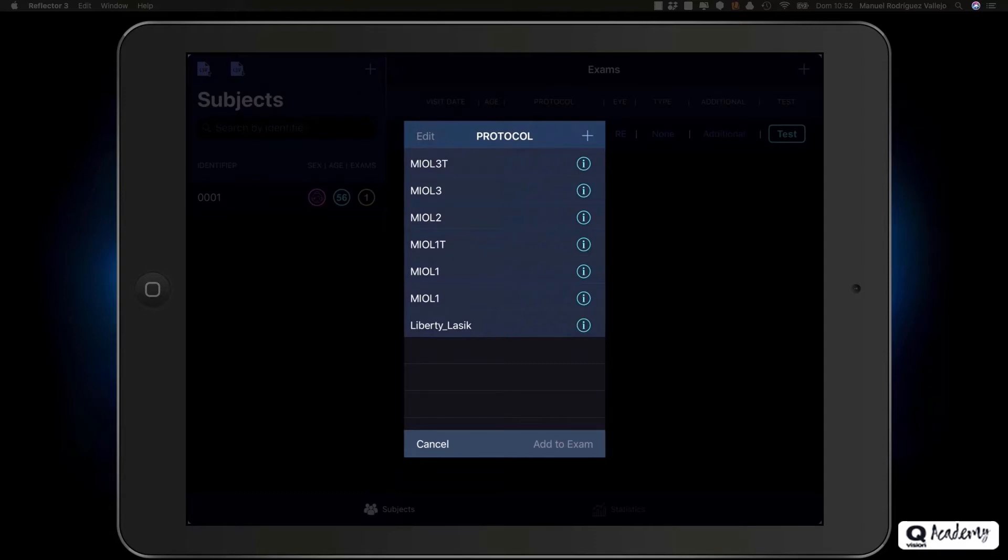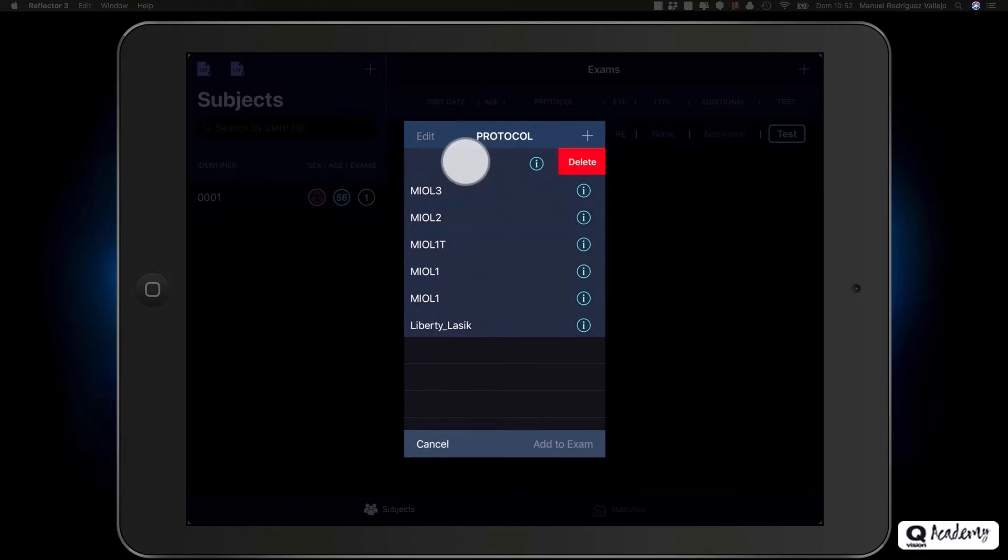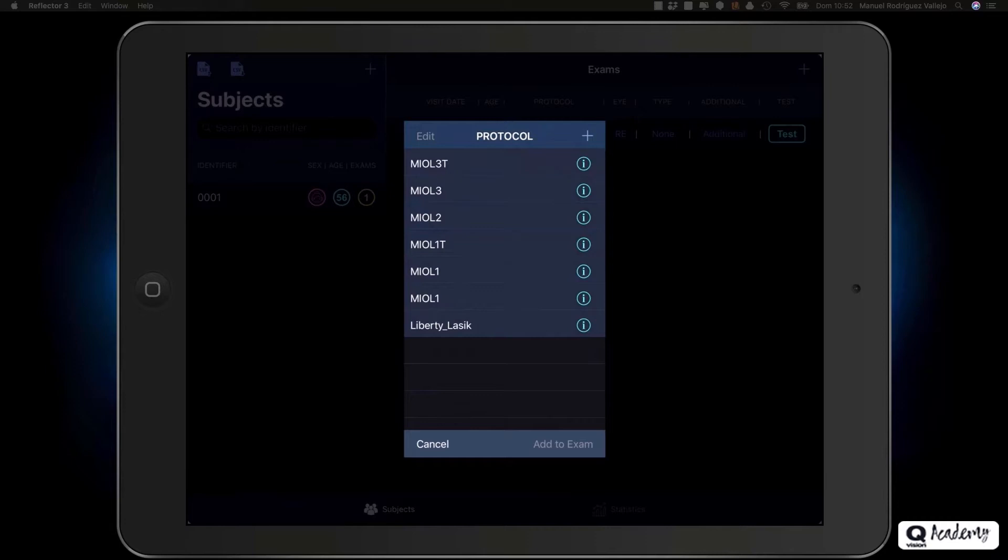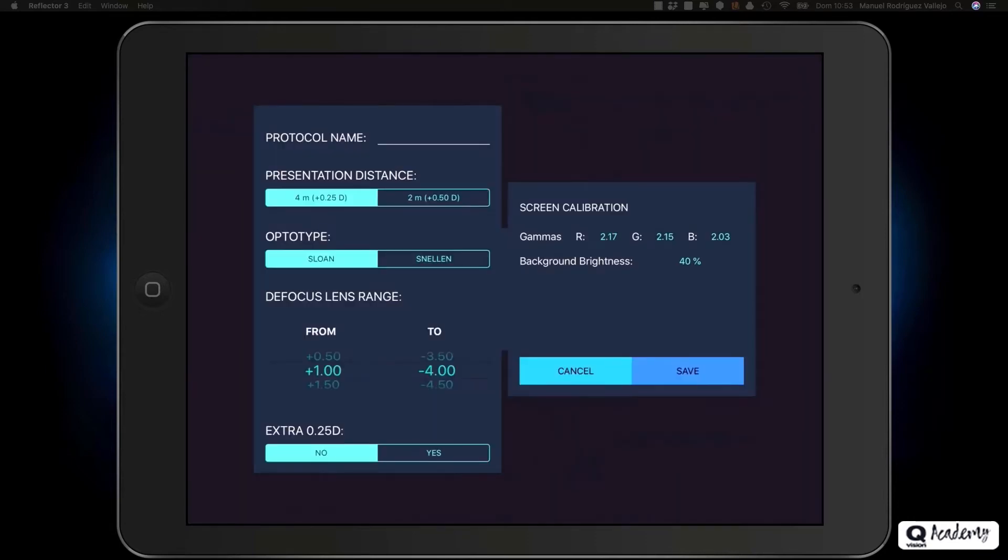In the protocol list, you can create a new protocol or edit the name of a protocol. If you choose to delete a protocol that has associated exams, the exams will be unlinked from the protocol, but will not be removed from the subject. To create a new protocol, click the plus button.